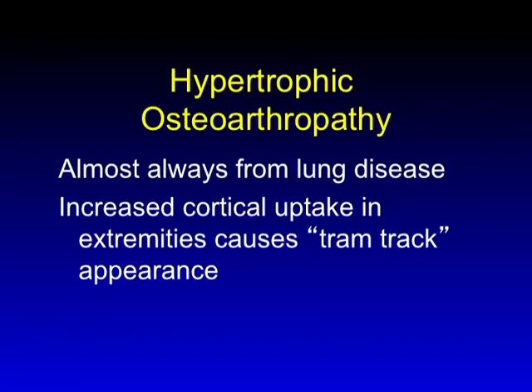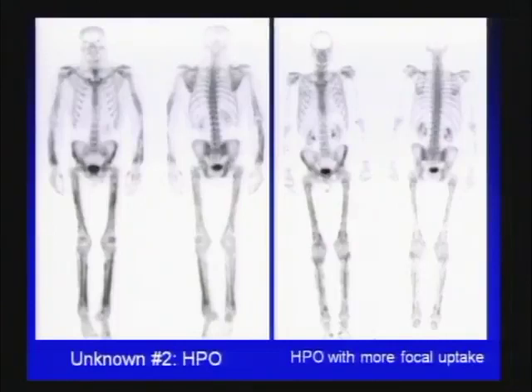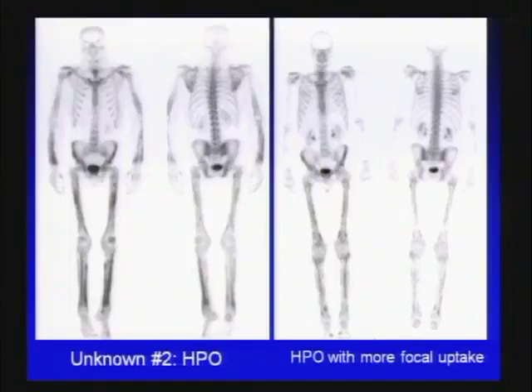Hypertrophic osteoarthropathy is almost always from pulmonary disease, and today it's almost always from lung cancer. It presents as diffuse uptake with a kind of tram-track appearance. This is the second unknown — uptake along the extremities, in this case the lower extremities as well as the upper extremities. Very diffuse uptake along the extent of all the extremities is classic for osteoarthropathy. This patient's diagnosis is lung cancer, the most common cause. The pattern shows a very smooth zone of involvement. Another patient, also with lung cancer, shows a slightly lumpier but still cortical peripheral surface lesion appearance — classic hypertrophic osteoarthropathy.